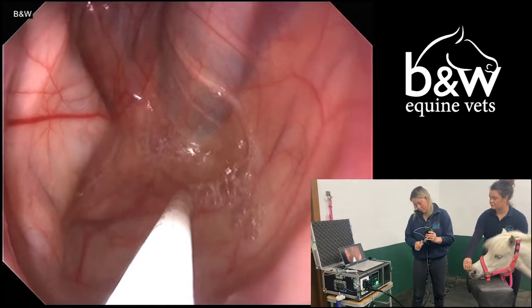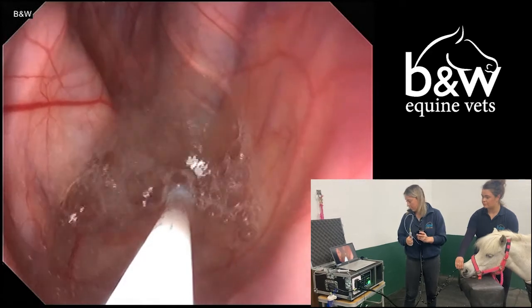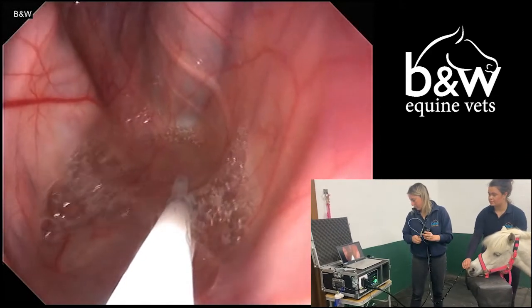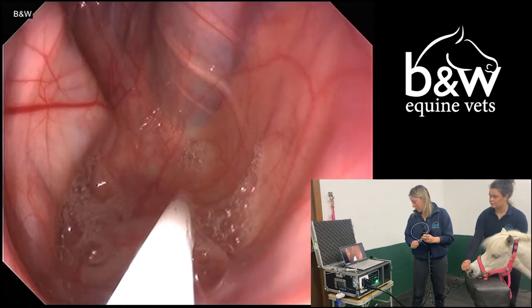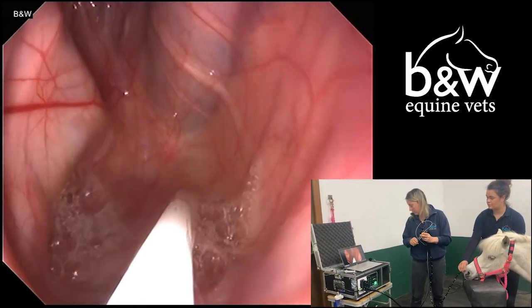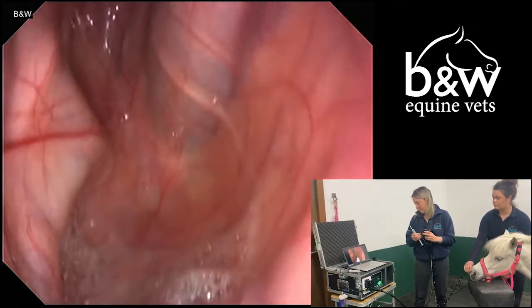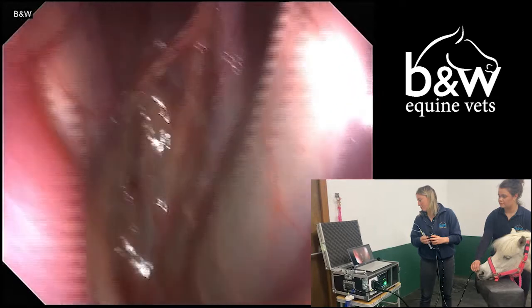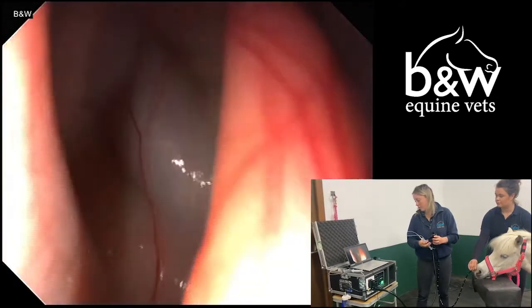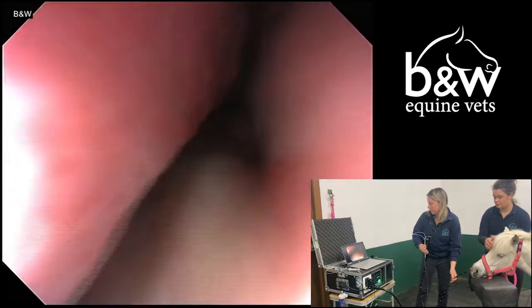As you can see, this procedure is completely pain-free and in no way harms the horse. Once the sample has been aspirated, we can quite simply withdraw the tube and take the endoscope out of the horse's head. To facilitate this procedure, the patient had received a small amount of intravenous sedative to help keep the patient calm and still and to enable us to perform the procedure as quickly as possible.